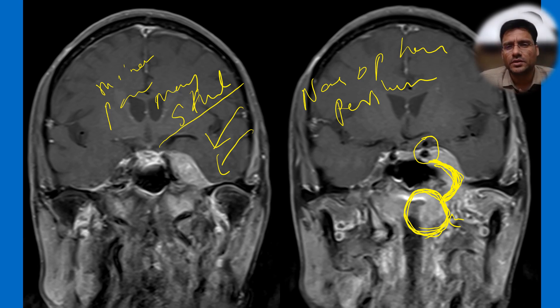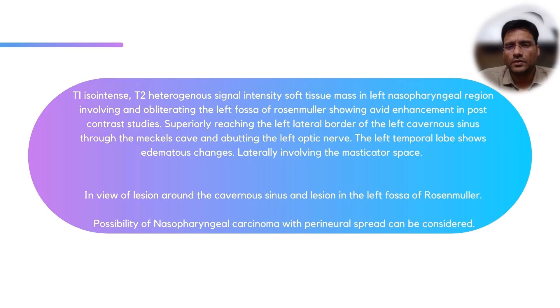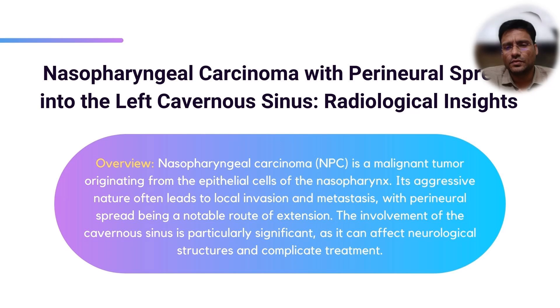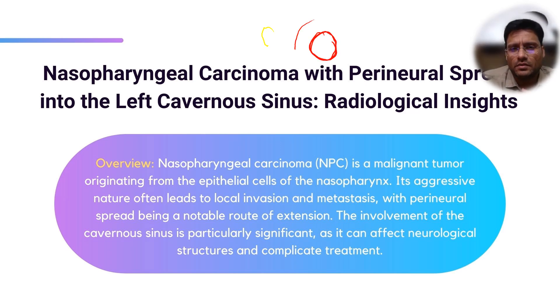Without the fossa of Rosenmüller mass, we would have called this a schwannoma or meningioma. This case was purely referred for brain MRI, but subsequently we went back to check the head and neck region and found the mass. Local invasion can occur and perineural spread also happens.